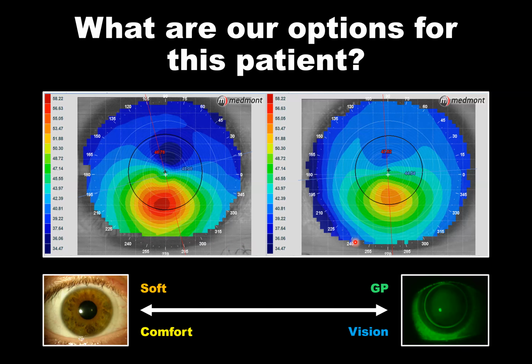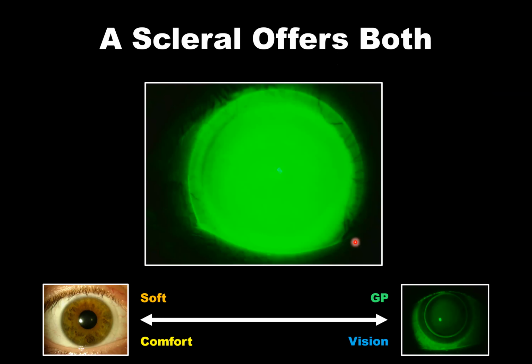So many of these patients are very, very challenging contact lens cases. And I know for those of you who have joined from the Middle East, from my experiences when I visited, the severity of some of these keratoconic patients that exist in the population are incredibly high elevations and incredibly asymmetric shapes. So I can have some appreciation of how difficult it is to fit some of those patients that are in your particular region.